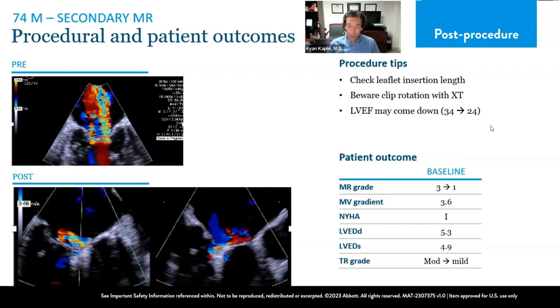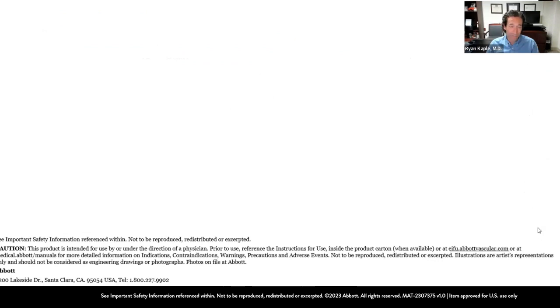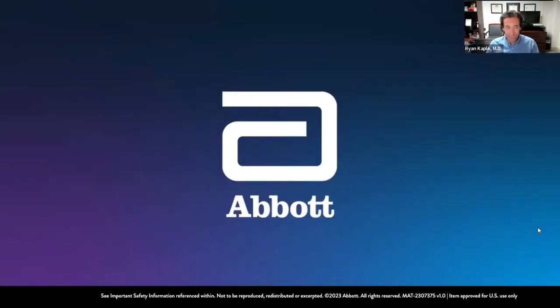We also often, when we drop the grippers, close the clip a little bit and lock, and before closing, check the rotation on 3D. Be aware that sometimes the ejection fraction will come down by a few points in the low EF patients, but know that the forward stroke volume has increased. Oftentimes you see blood pressure going up, left atrial pressure going down, which is certainly a sign of better outcomes for those individual patients. But I also always warn my patients that we may be looking at a lower ejection fraction when they come back and follow up. But if they're feeling better, that's really what the important thing is.